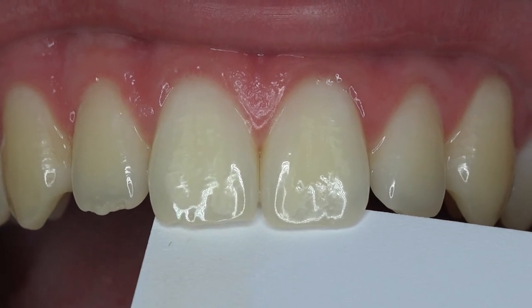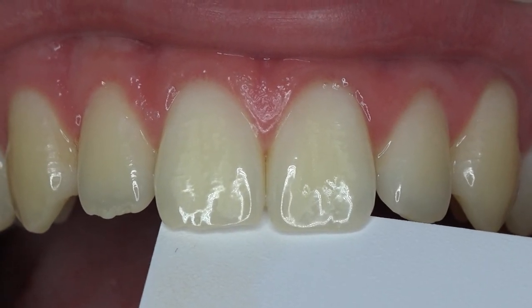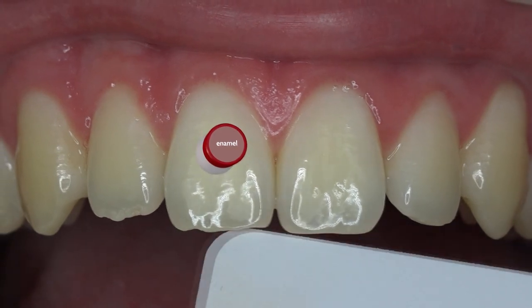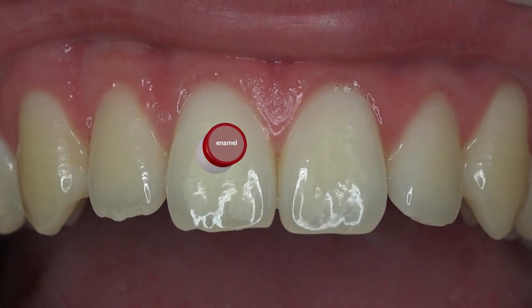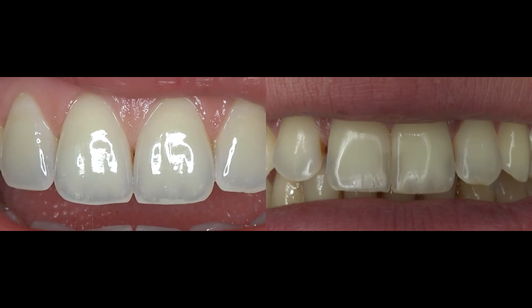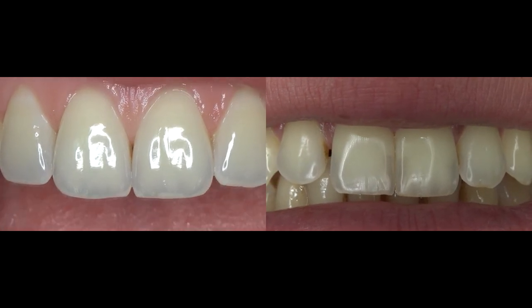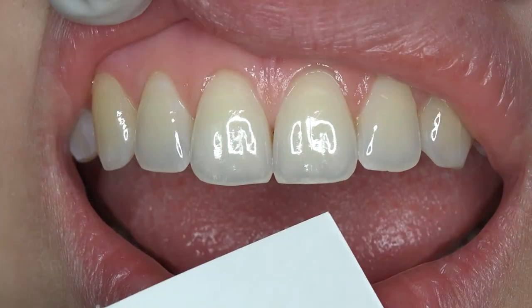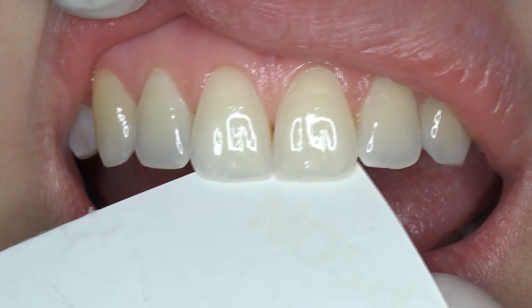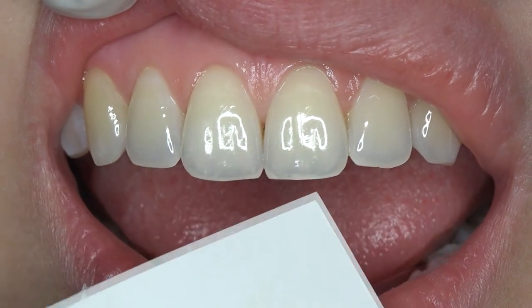For example, in this case, the enamel transparency is quite low, so enamel ceramic or composite may work. On the other hand, in the first of these two patients, where both appear quite transparent frontally, no obvious color reflection occurs when white cardboard is applied at the incisal edge.